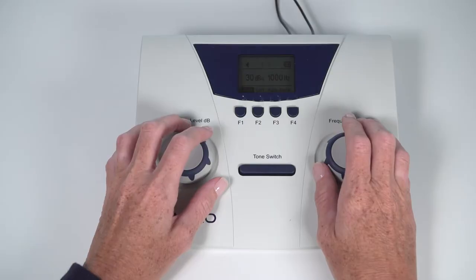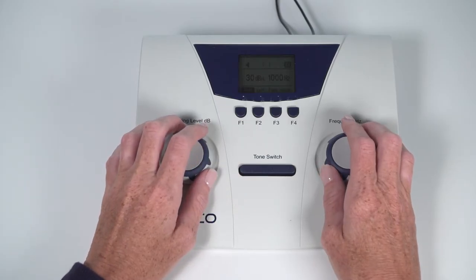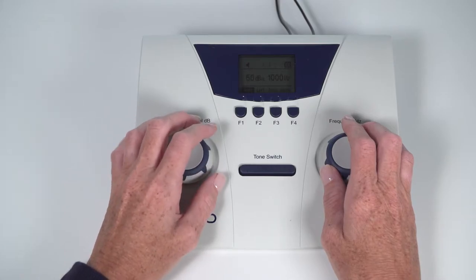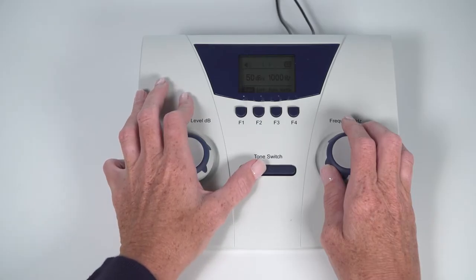Placement of the audiometer is important, as you don't want the child to see your hand movement or presentations of the tone. Have the child turn slightly away from the audiometer. Select the right ear, select the frequency of 1000 Hertz, and select a volume level of anywhere between 40 to 60 dB HL. This level is used to condition the child to the test signal so they know what to listen for during the actual hearing screening test.